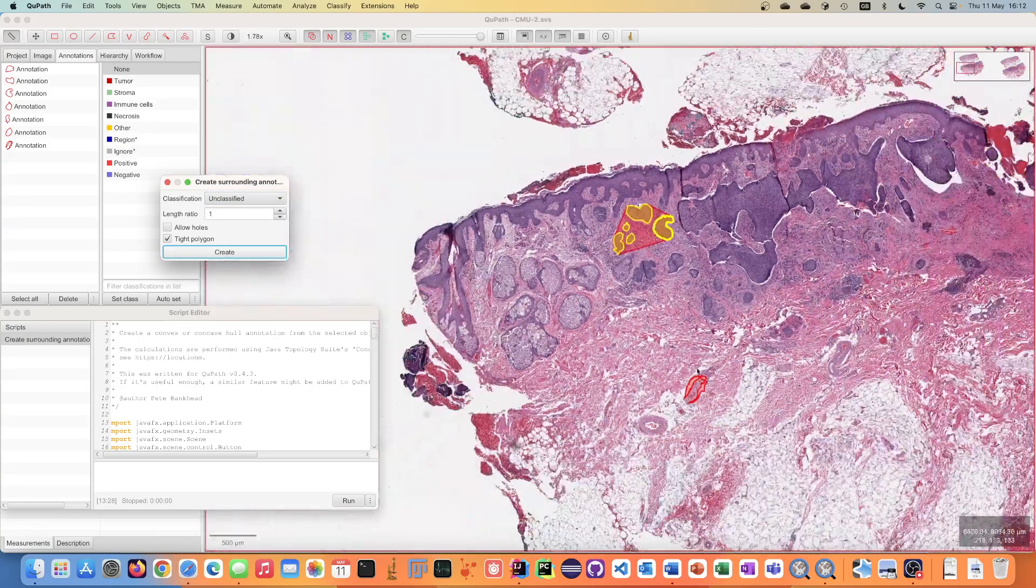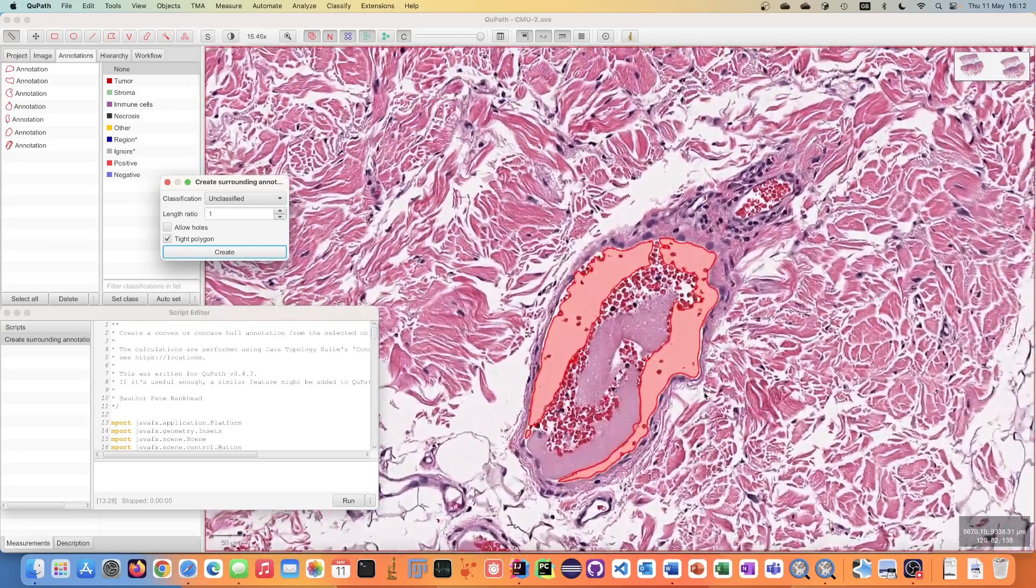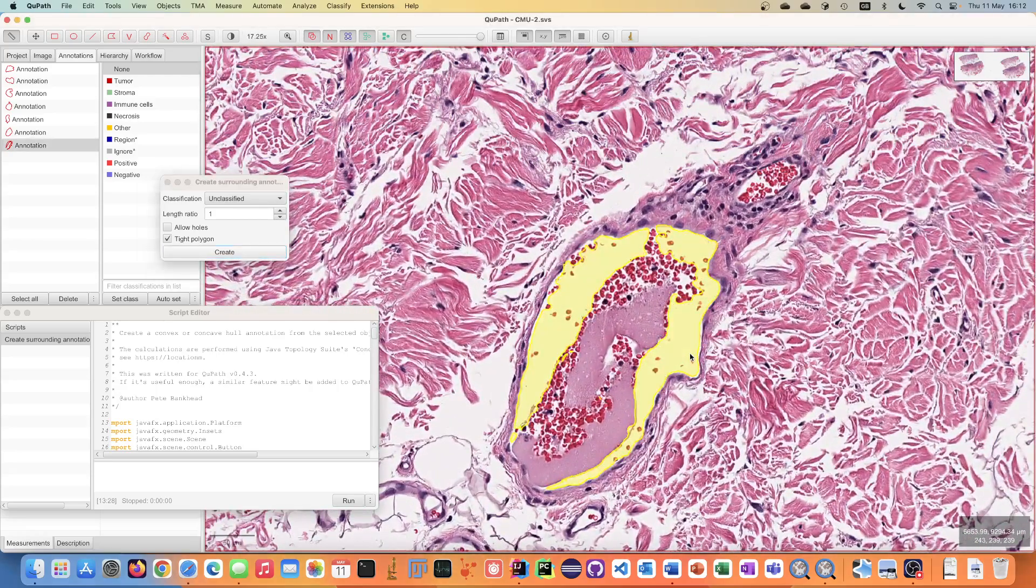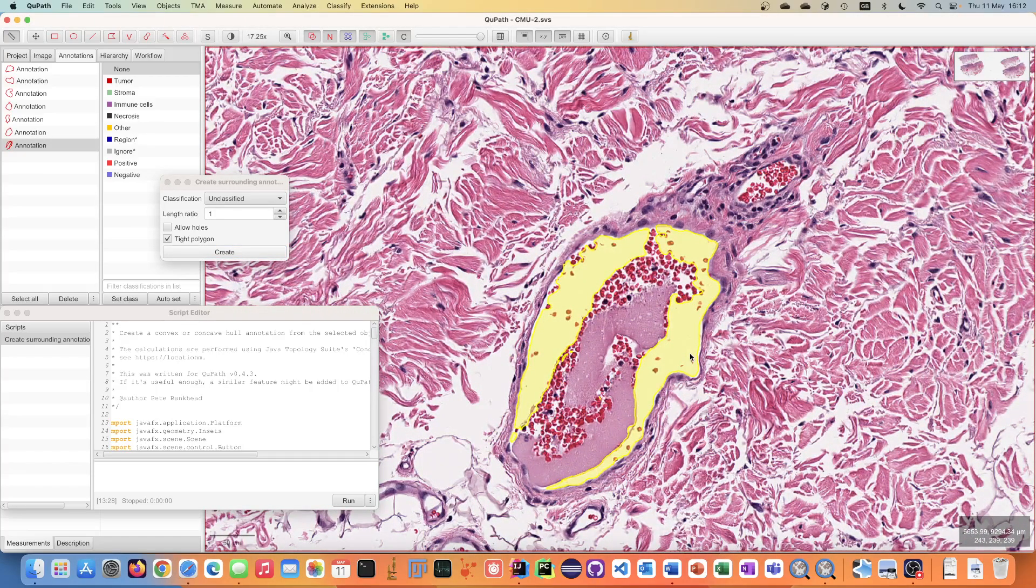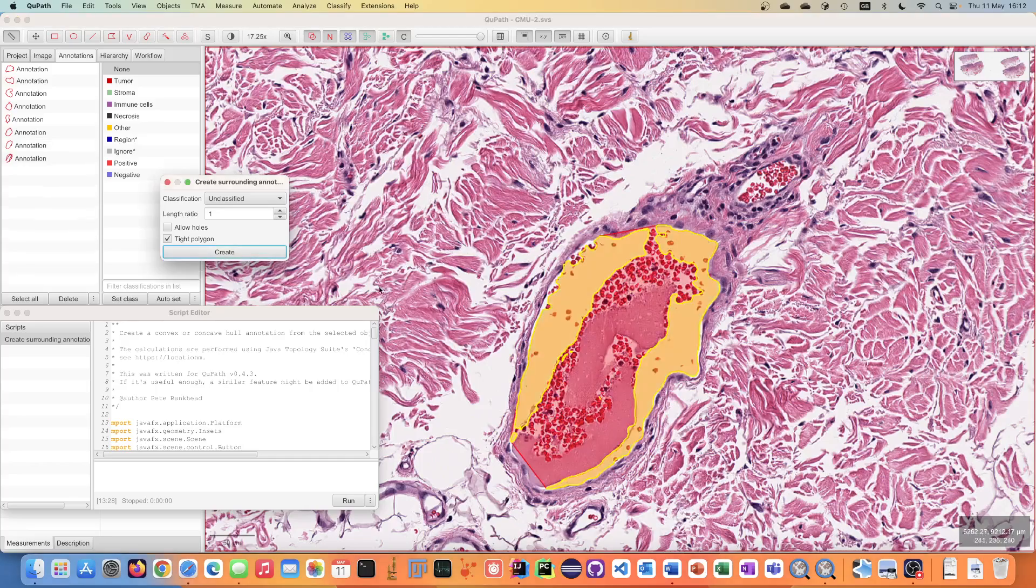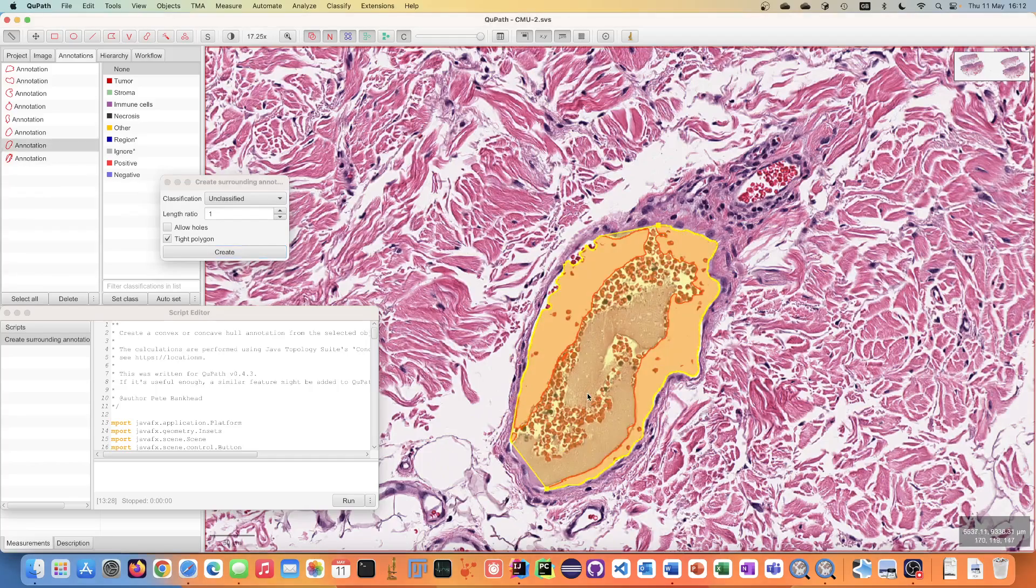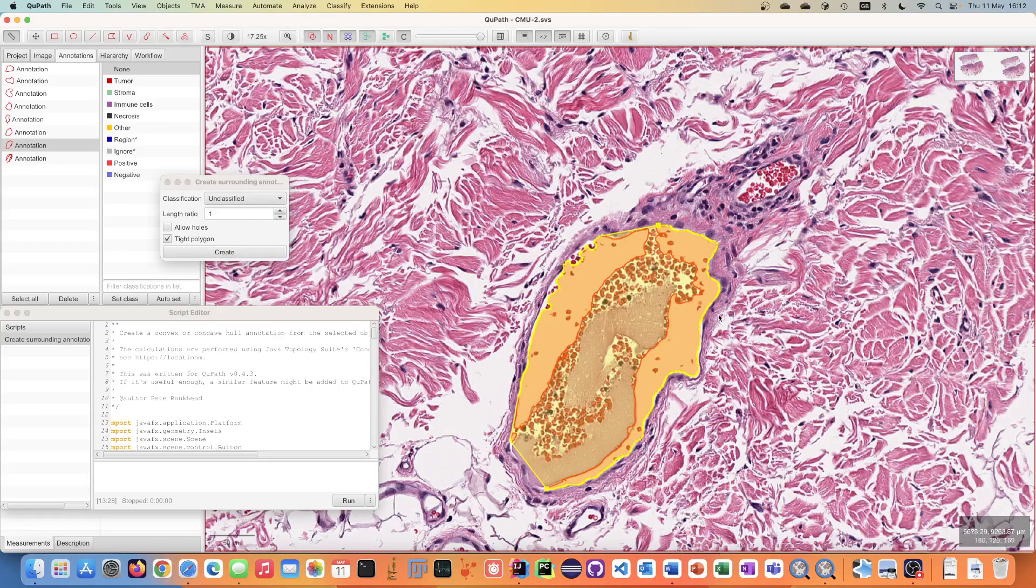One of the purposes of this is to help with cases where you might have an annotation but it's incomplete. So for example here, running this would be able to fill in the gap and give a solid annotation as opposed to just annotating the white parts around the edge.